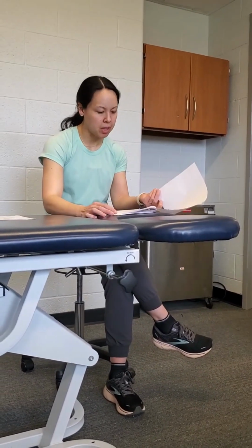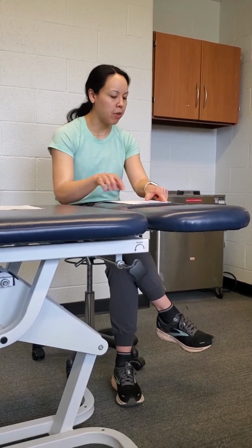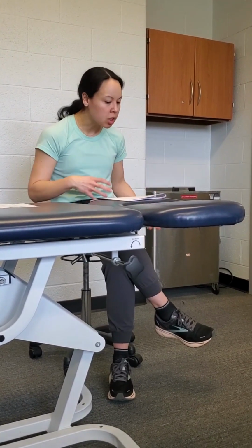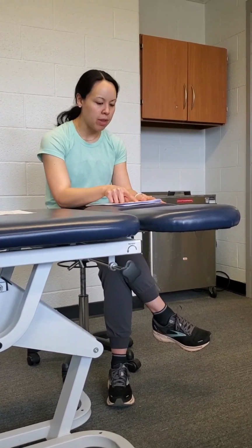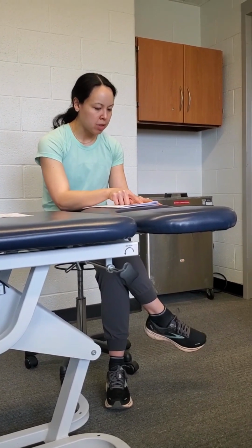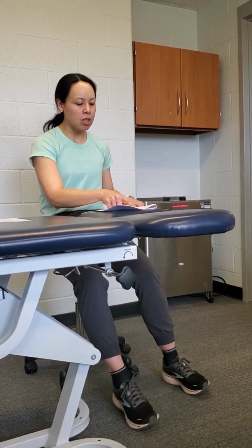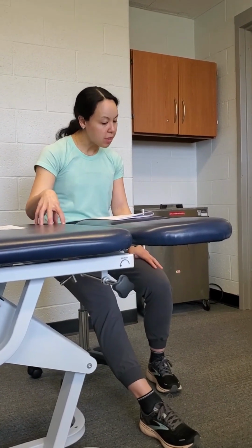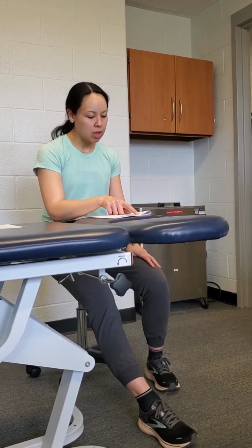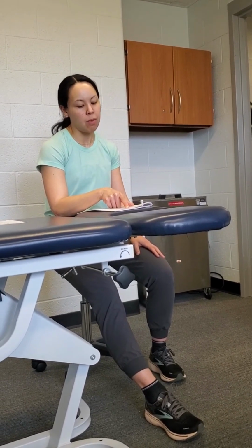Exactly. And this brings up the next section, doing BFR in combination with neuromuscular e-stim. You can pair them together, and the studies have shown, for example, investigators applied the neuromuscular e-stim at both 60 to 90 degrees of knee flexion without BFR, then applied BFR with the stim, and that actually increased the stimulation to 10 to 30% of muscle contraction.